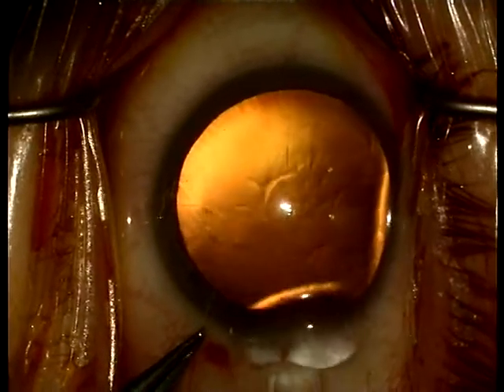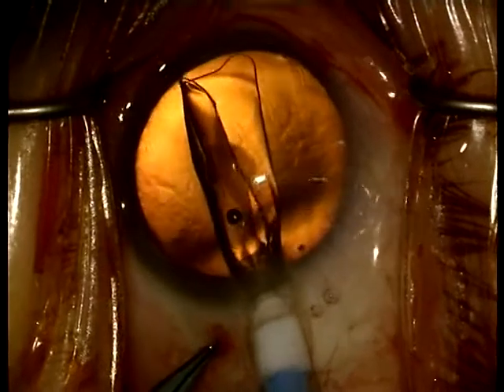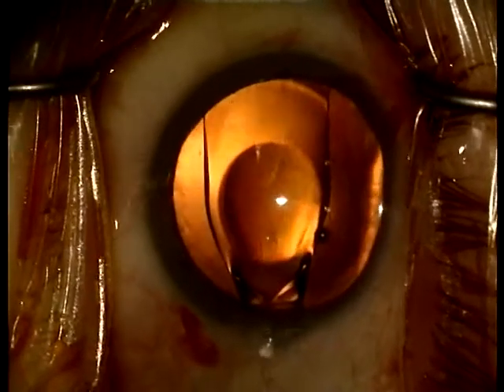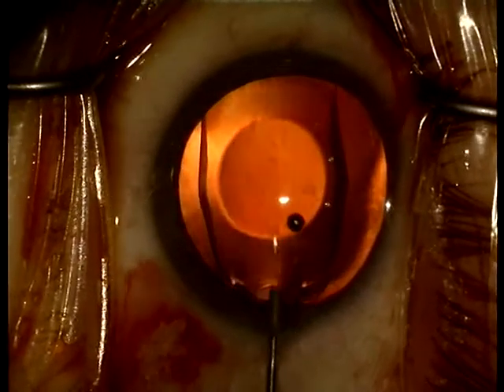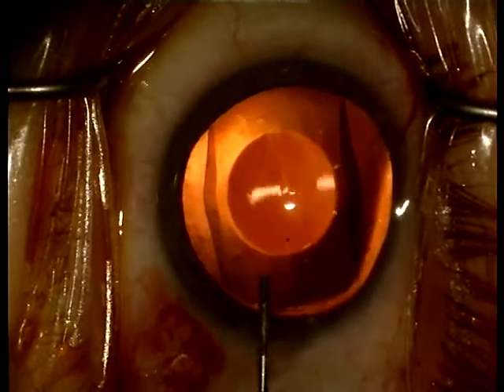The cartridge is then placed firmly against the incision and the ICL is injected. Wait to remove the cartridge until the distal part of the ICL is unfolded. To push the lens downwards a little bit of methylcellulose is placed on top of the intraocular lens.